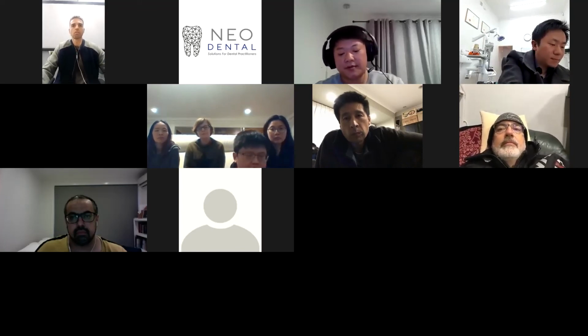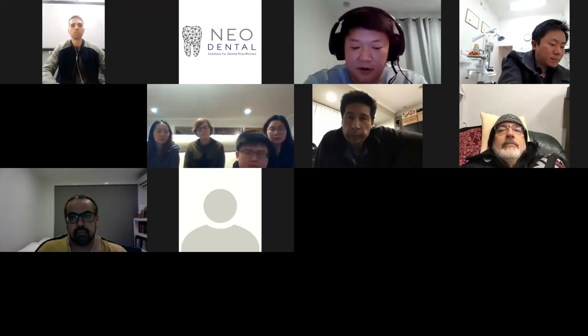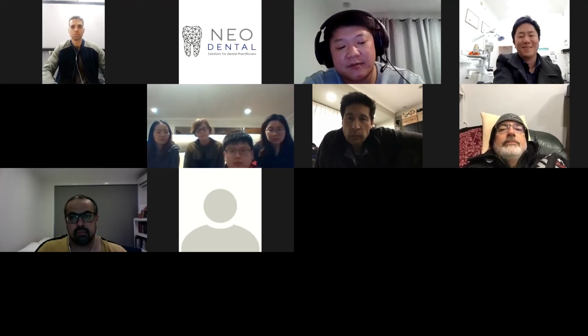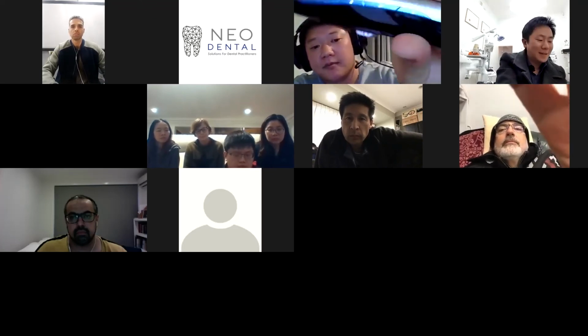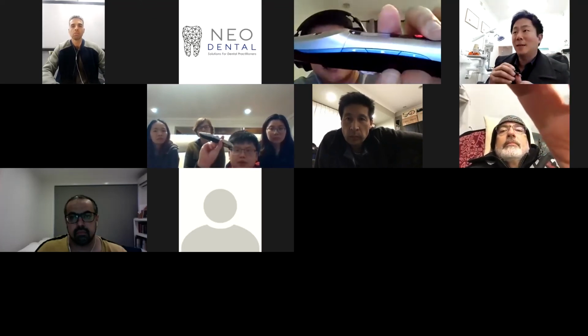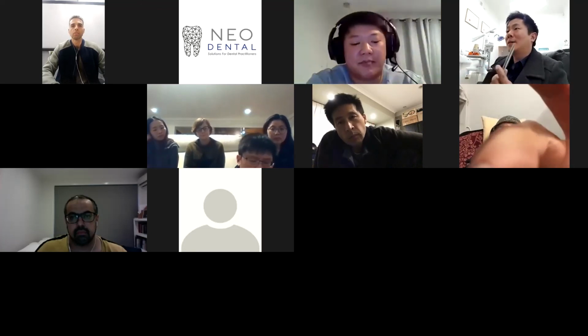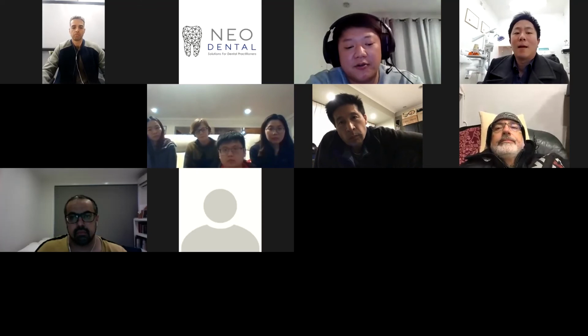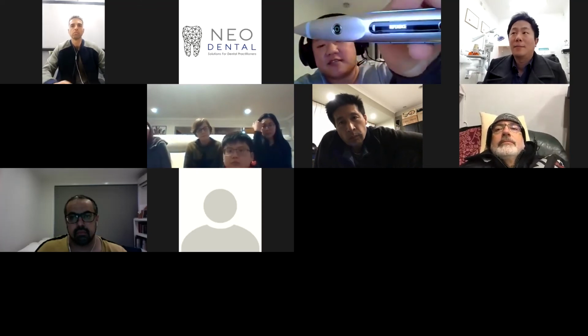The mode. Yep. So when you turn on your machine, it'll say welcome. You push the little button with the dot on the bottom. There's an arrow key left and right and a dot. You push the dot button 4 times, and that'll get you past your PIN code, and then there'll be a little screen that says reference.